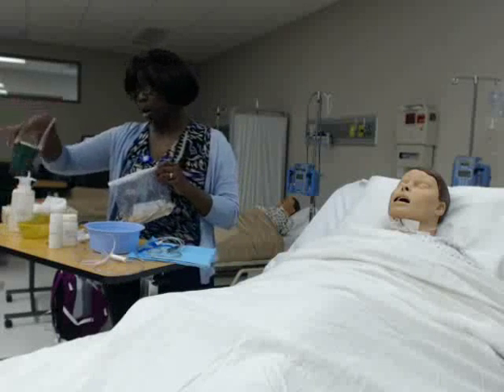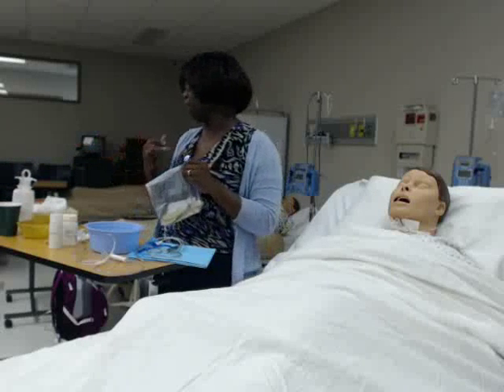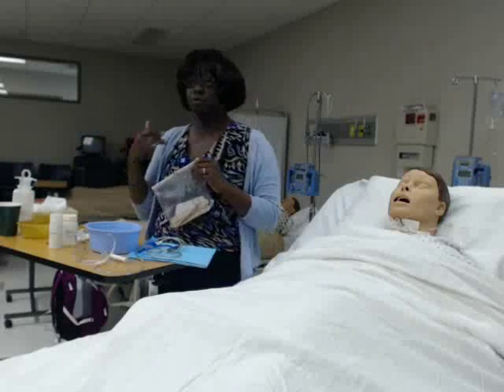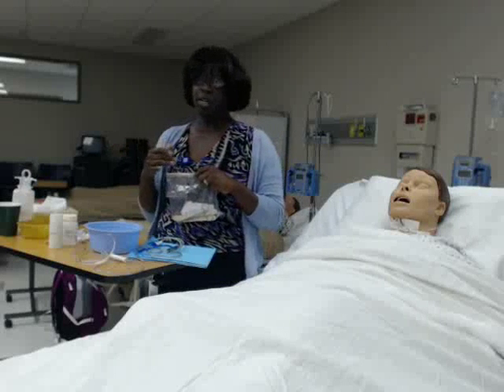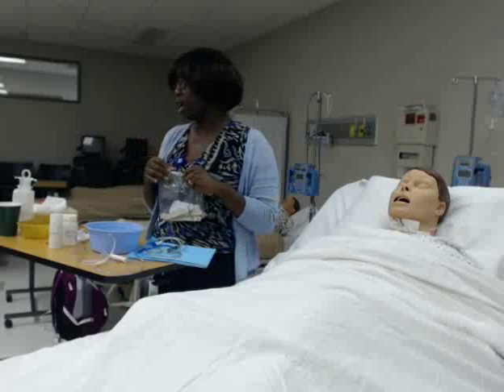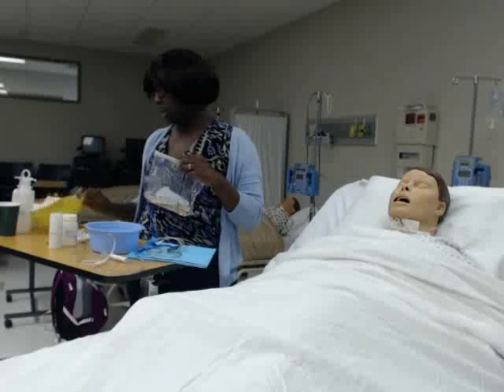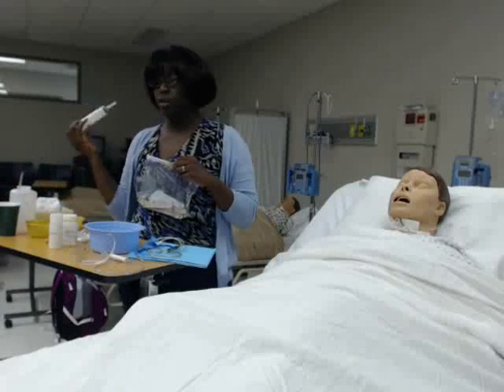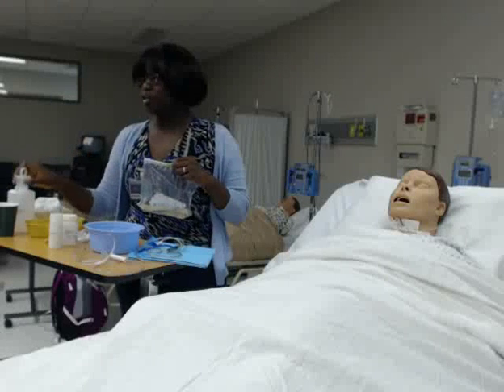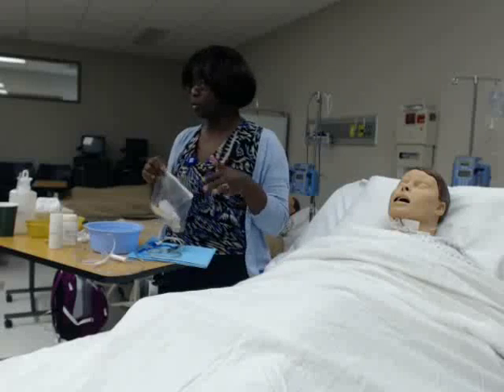We want a cup of water — just a small amount. We don't want the patient taking big gulps; we want small sips, because big gulps can increase their chances of getting nauseated and vomiting. So we want an emesis basin just in case, and some tissues. You also want to have a syringe because after insertion you have to check your placement — I'll go through how to do that.